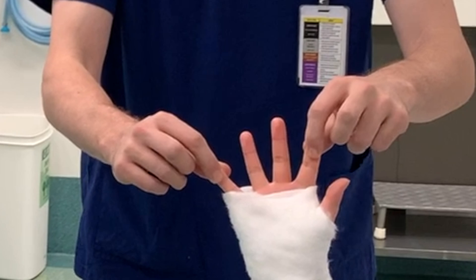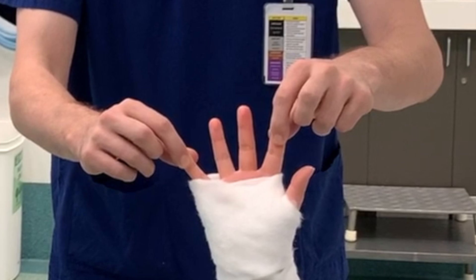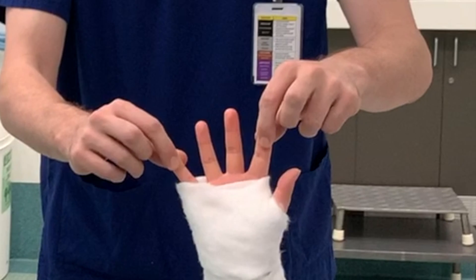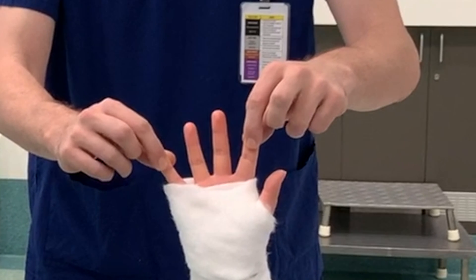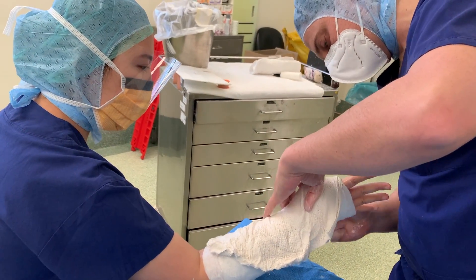If an assistant is present, ideally the assistant will hold the patient's index and little finger apart during plaster application so that when the plaster sets, the fingers are not in a crushed position. This is to ensure adequate movement of the fingers once the cast sets.